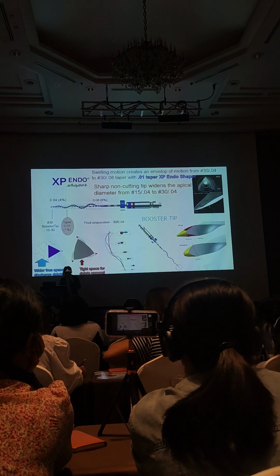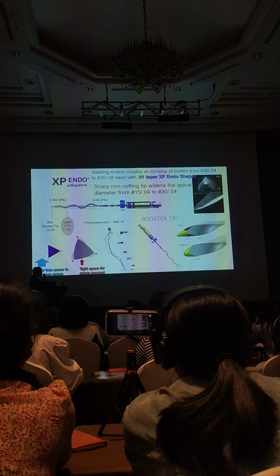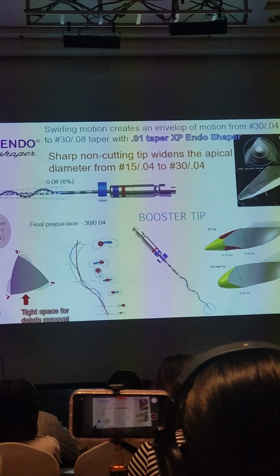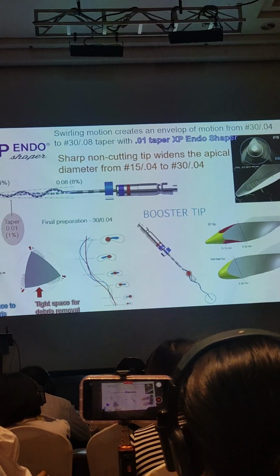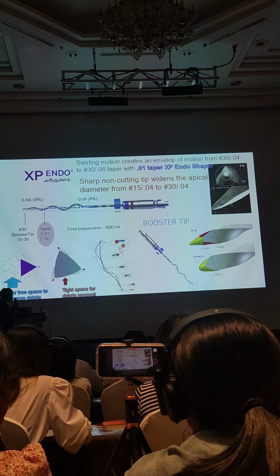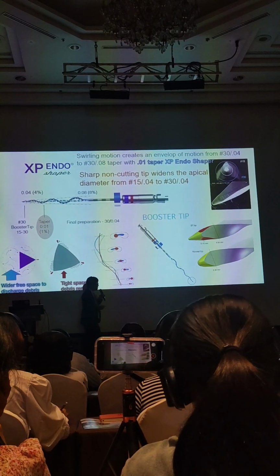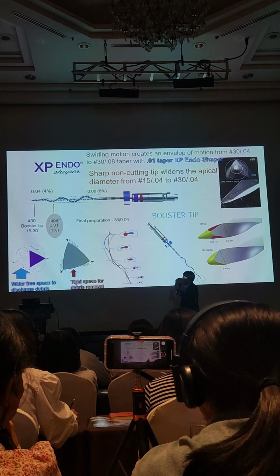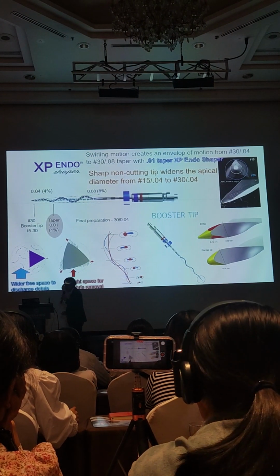So I use this one because of those reasons. And if you spin it in an oval root canal, it goes right and left, like this, right and left. You can touch all over the root canal walls because of the small taper and snake-like shape. So I want to use an instrument different from the conventional rotary instrument. That is the XP Endo Shaper. You can use this to remove the gutta-percha fillings mechanically.